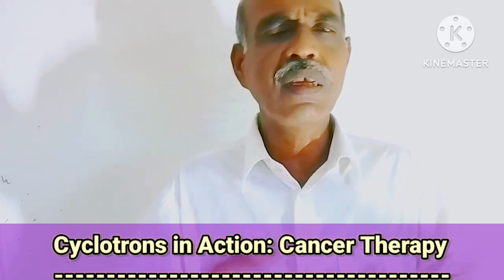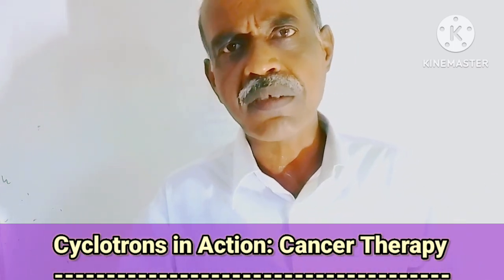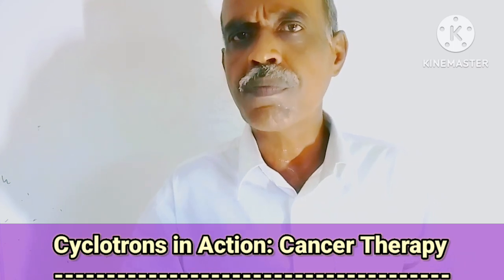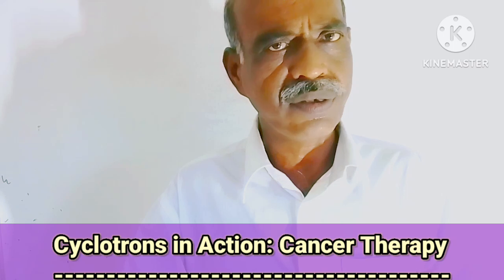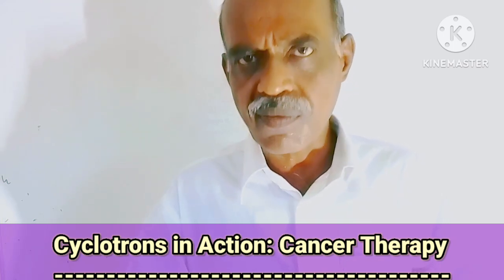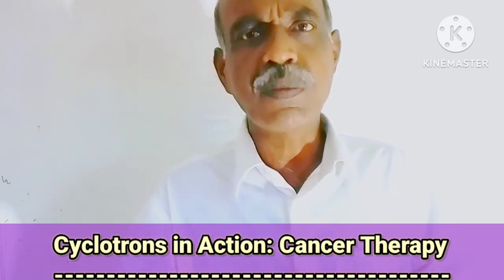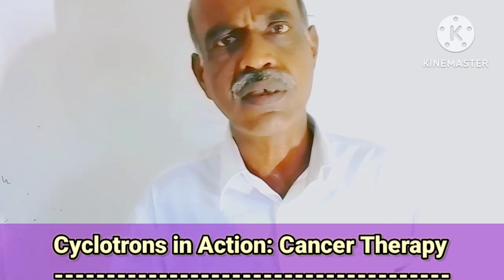Normally, what is the range of energy in these cyclotrons used for medical purposes? It is almost 70 to 250 MeV, where MeV means mega electron volts. When the energy is 70 MeV, the speed of the protons is almost 34% of the speed of light in vacuum.